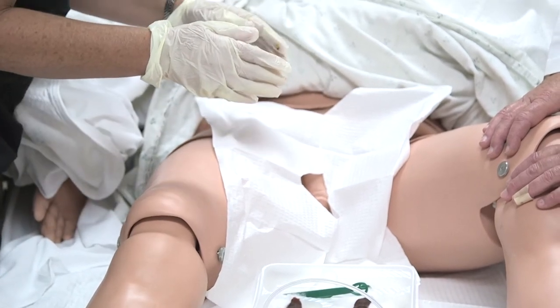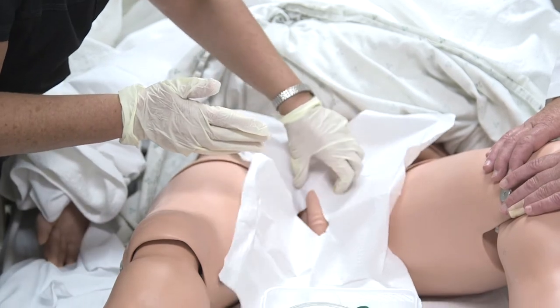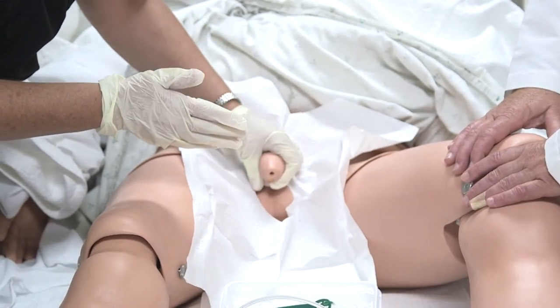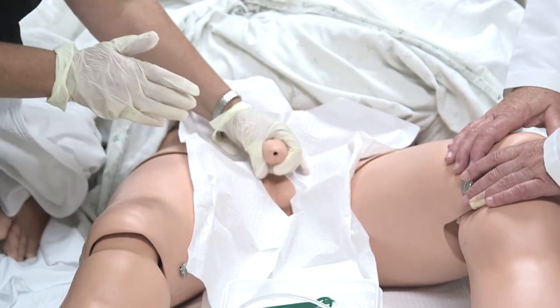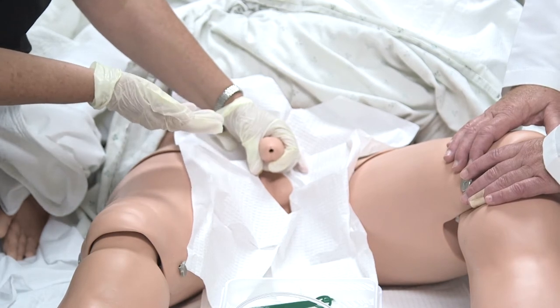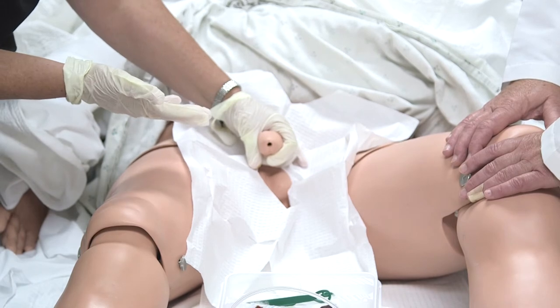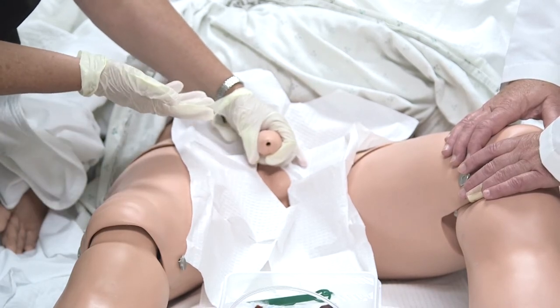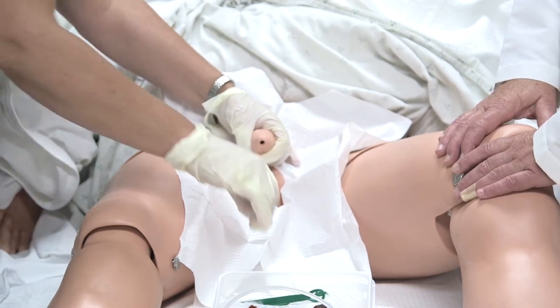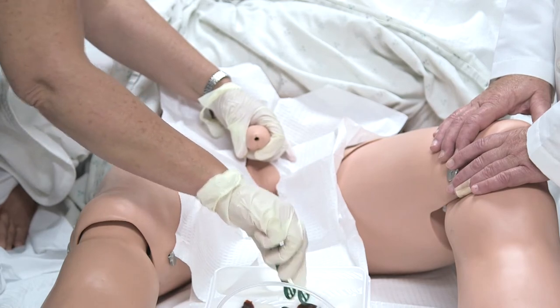All right. So Tim, it's going to be a little cold, but I'm going to go ahead and start putting that catheter in. Okay. So I'm just going to grab here. A word of advice, if they have foreskin, you have to push the foreskin back so that you can actually visualize the meatus. And hopefully when you did pericare, you've cleaned under there and everything. But if they have foreskin, pull that back. And then make sure when you're done to put it back down, because that can cause problems for the patient. If you don't, they can start to get swelling and stuff in there.